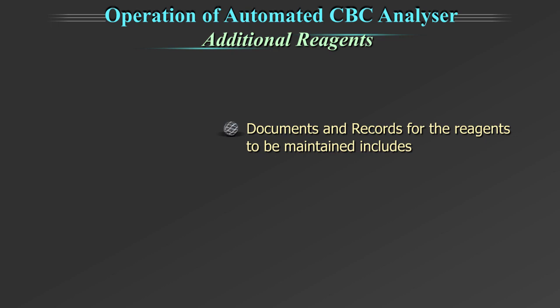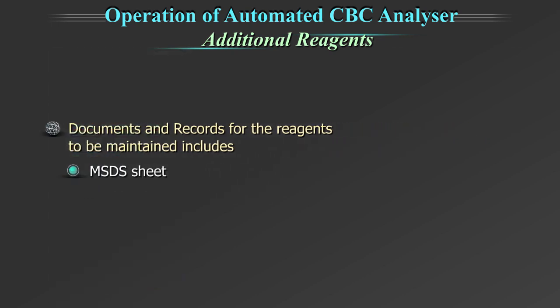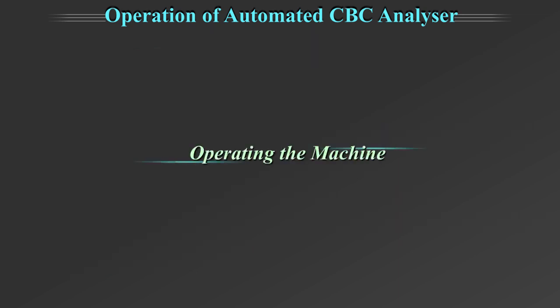Documents and records for the reagents should be maintained, which may include the relevant MSDS sheets for each reagent, reagent insert files, reagent opening records, and indent records. Let us now start operating the machine.